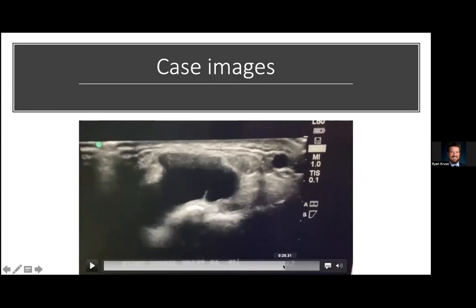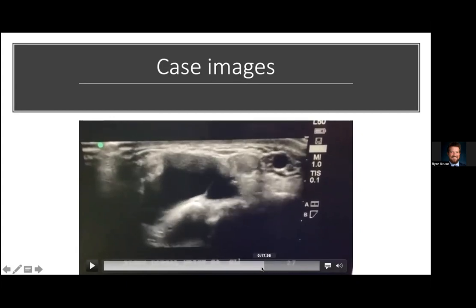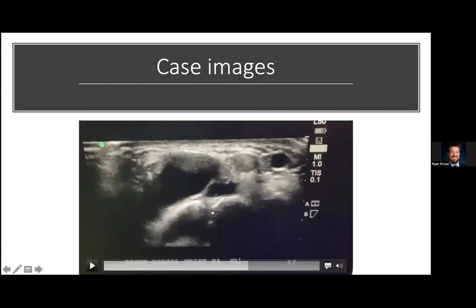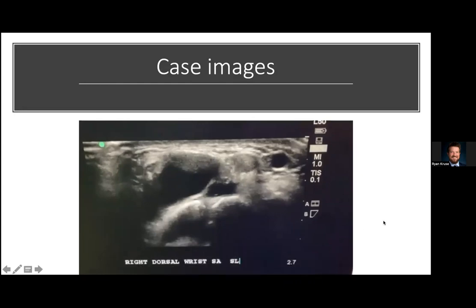In this view, we did a dynamic stress where we had the patient make a fist, and we watched this spacing — it did not increase. We felt pretty confident that although there seemed to be a tear on the dorsal aspect, overall that ligament and the stability was still intact. That was important to evaluate for him.